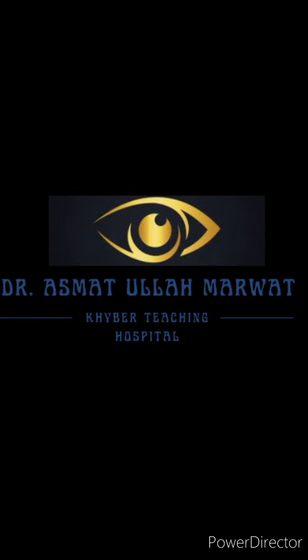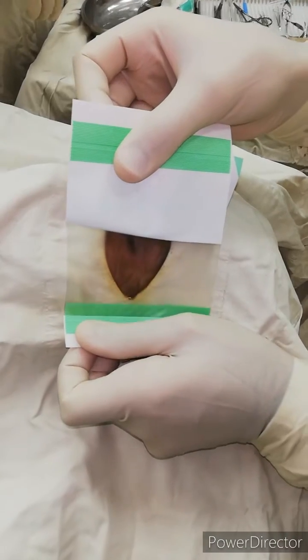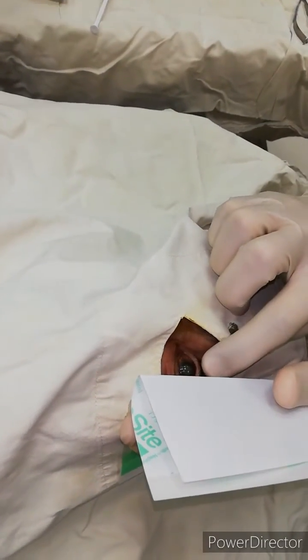Hello everyone, I am Dr. Asmatullah from Khyber Teaching Hospital. Today we will learn how to apply the Opsite drape at surgery. The Opsite is half open, half paper.